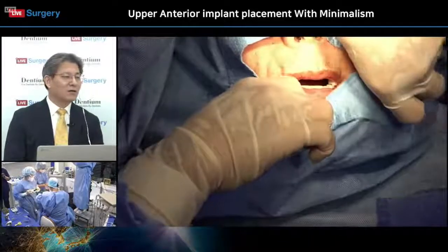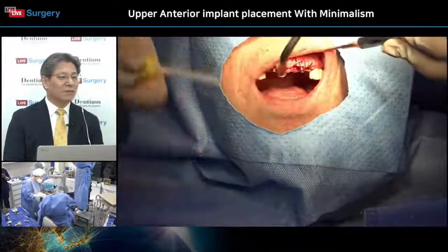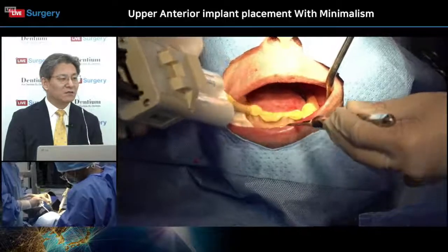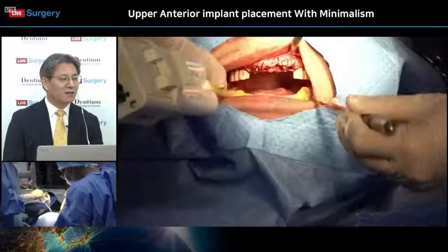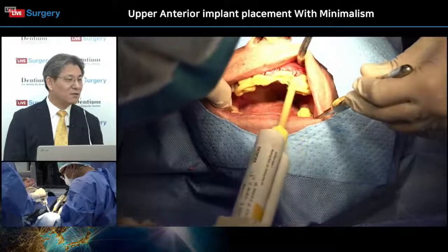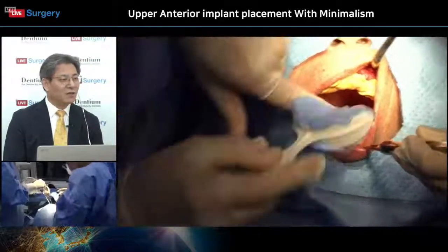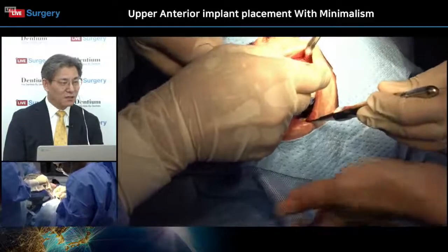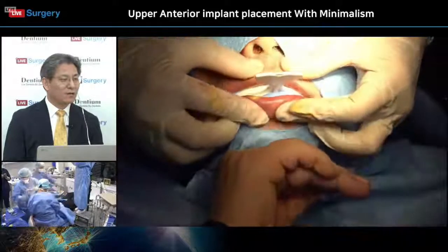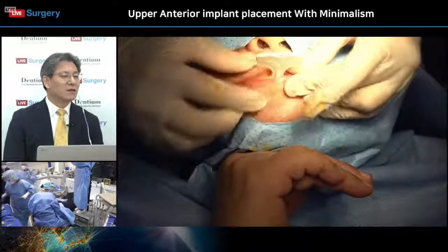Okay. So loading is finished. Loading the rubber impression material on the bite tray. We do putty, and the light body is good enough. Yeah, this one is the light body of the Bright impression material. This one is with a little bit of a bleeding spot. Yeah, it's good. Light body injection type. This material is also made by Dentium company. And after that, ask the patient to push the chin. Okay. And finally, we can. Then gently push the material outward with your tongue. Okay, well done. Now relax your tongue and stay still.